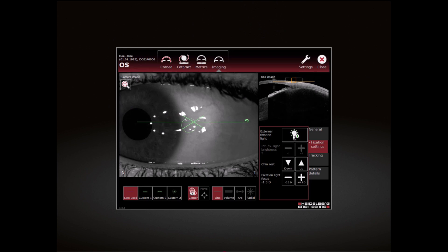For image acquisition of paracentral structures, example the sclera, the tracking function should be disabled.